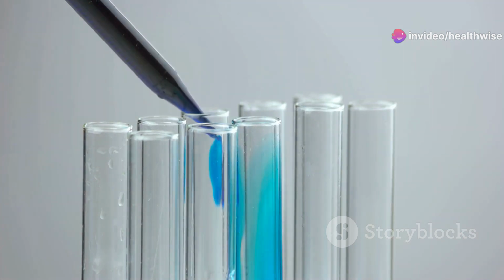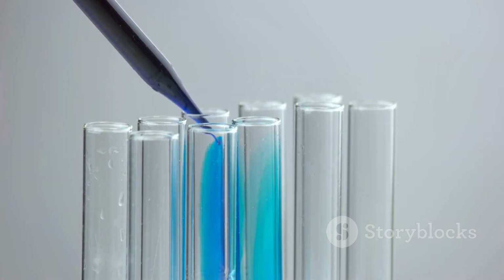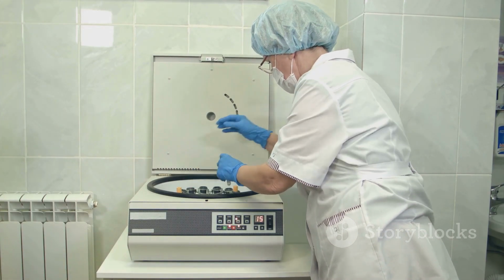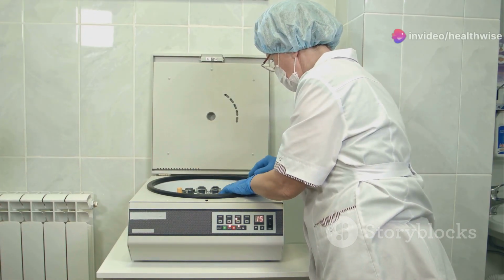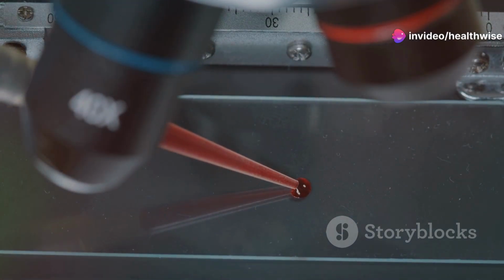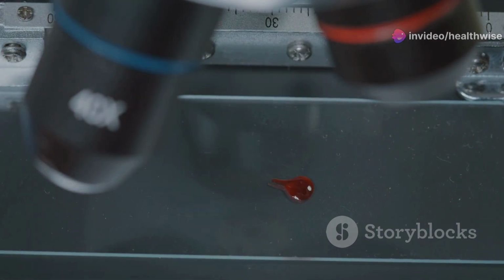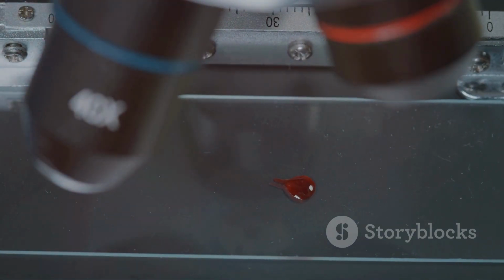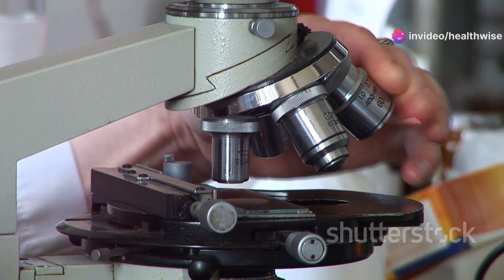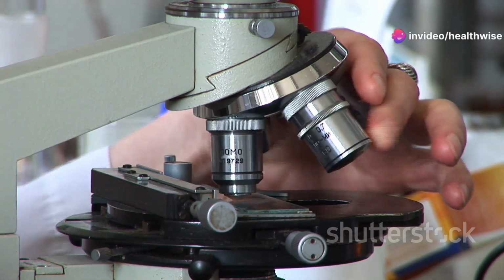Resuspend and fill the tube to within 0.5 centimeters of the top with zinc sulfate solution. 7. Centrifuge for 2 minutes at 500 xg and allow the tube to stop naturally. 8. Without removing the tube from the centrifuge, touch the surface of the suspension with a wire loop and transfer the material to a slide containing a drop of dilute iodine or saline. 9. Examine the slide immediately under the microscope to avoid distortion of the ova.